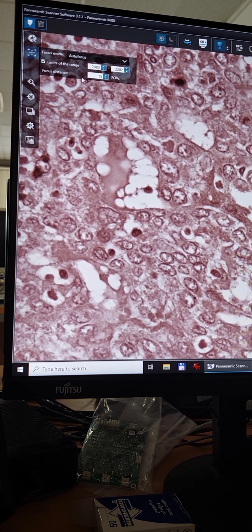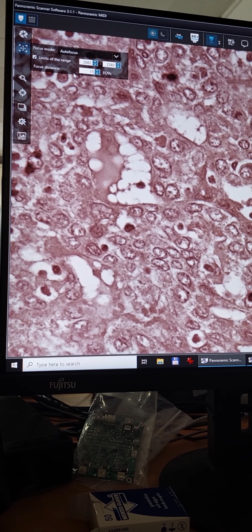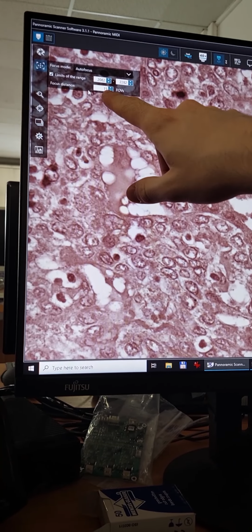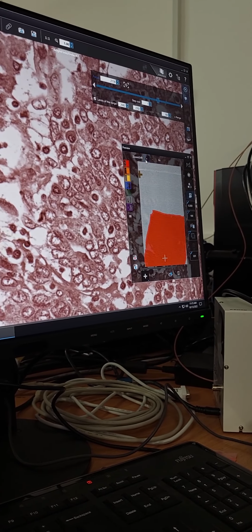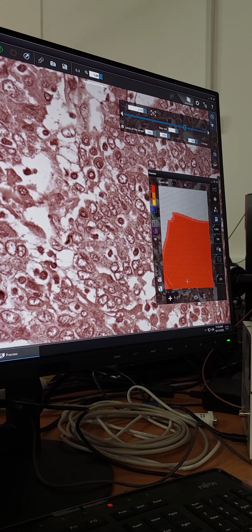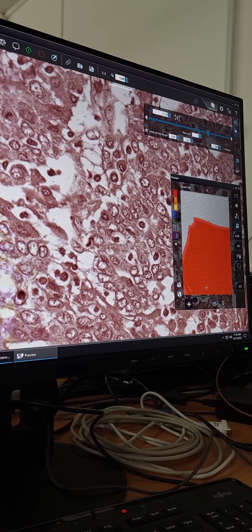So if you have the scanned area, before the scanner grabs the images, it has to build a focus map, so where to grab those images in Z. What it's going to do in the autofocus function, in case of the 15 setting, is that before scanning, it is going to stop at every 15th field of view, and it will quickly try to find the focus within that range. Every 15th one.